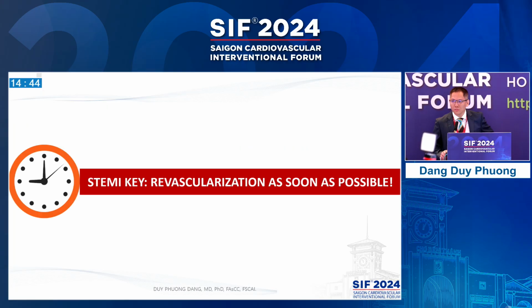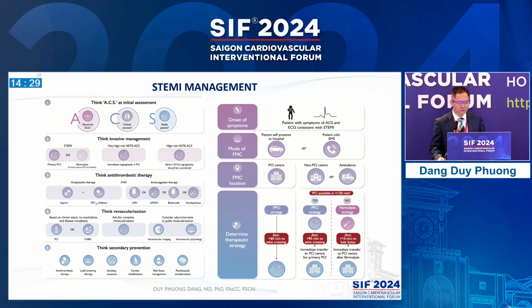Today I'm honored to present tips and tricks to deal with large thrombus burden in STEMI patients. We know STEMI, we see it every week, every day, and the problem is the occlusion of the artery. But the key of STEMI is revascularization as soon as possible, very quickly.